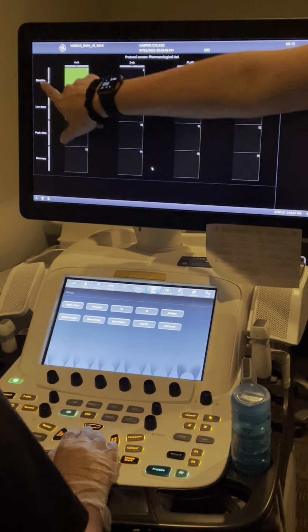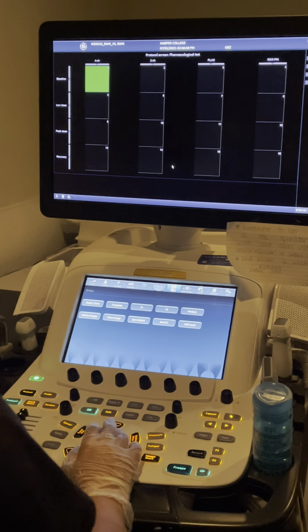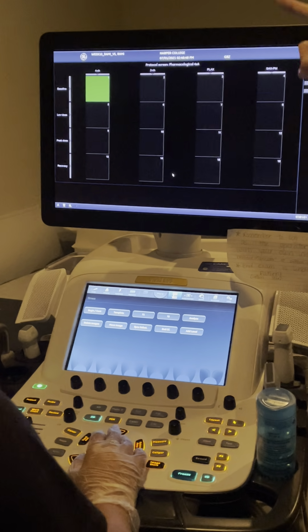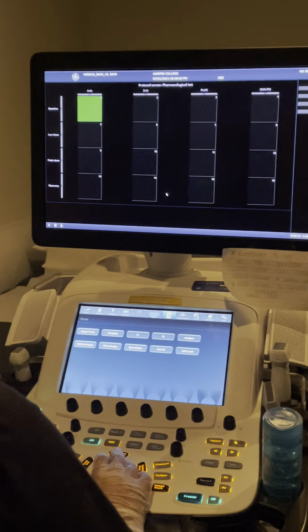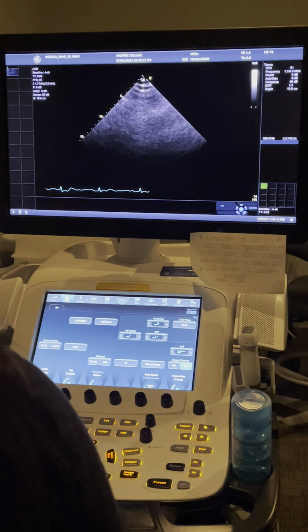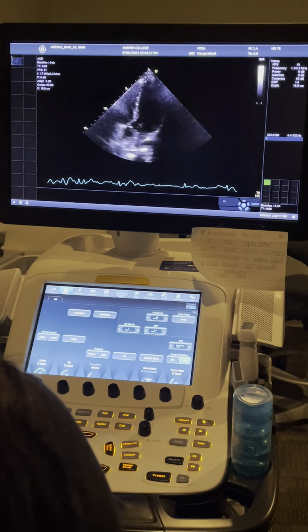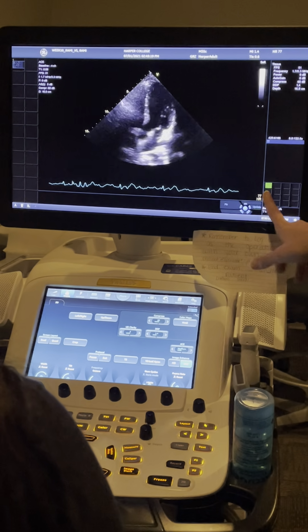We're going to start in our 4-chamber for our baseline images. Baseline is when they haven't been given any medication yet. No dobutamine has been started. So these are your resting pictures. So you're going to push begin, and we'll start in our apicals. Again, set the depth appropriately first here, and you'll be on axis for everything for your long and your short. That's why it's nice to start in apicals.